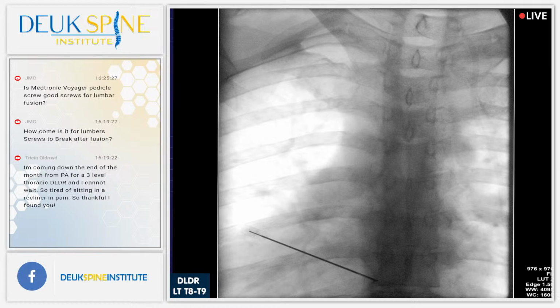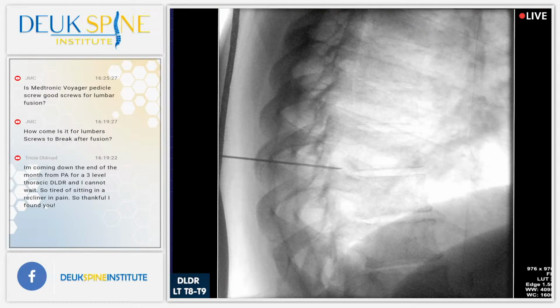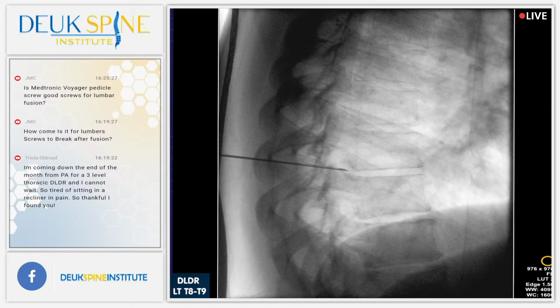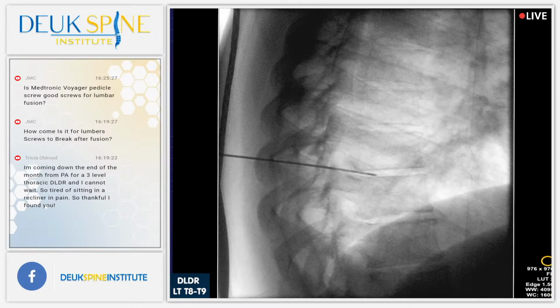And now I'm going to enter the disc using lateral fluoro to guide me. I want to get in about maybe halfway into the disc, 1/3 to 1/2. And then we're going to bring the guide wire. We'll do our discogram, guide wire, and then the endoscope. Shot. We're inside the disc. We successfully got in. Our patient is asleep because he doesn't tolerate being awake very well.